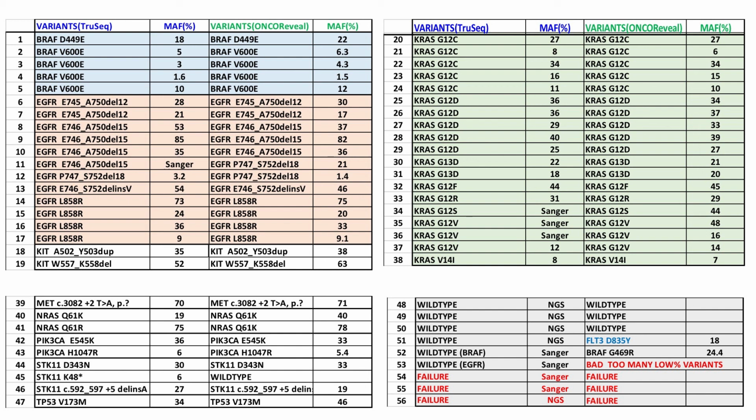There was one sample that could not be sequenced by the TruSeq, but we were able to Sanger it. Sanger is much more forgiving, for those of you who know Sanger. And we tried this sample on the Pillar technology. We tried it twice. The first time it gave us some problems. The second time it worked, but still with low coverage, and I wouldn't confidently say that it was really excellent for reporting. This is a problematic sample. We went back into re-extraction, and then it worked much better.